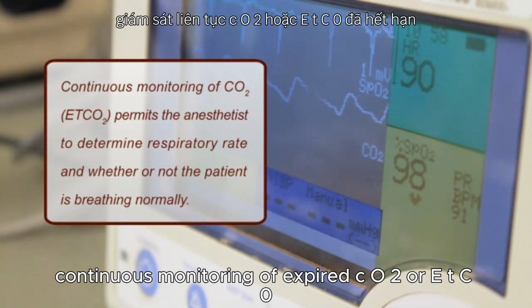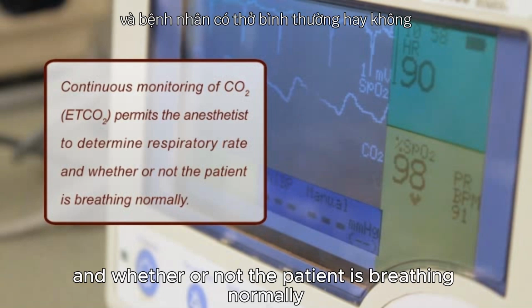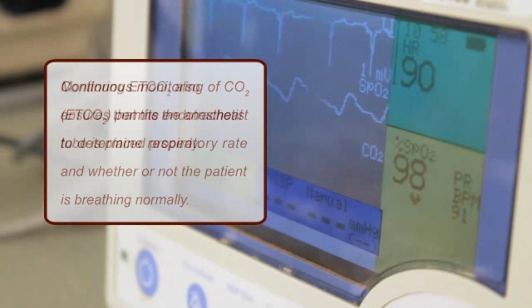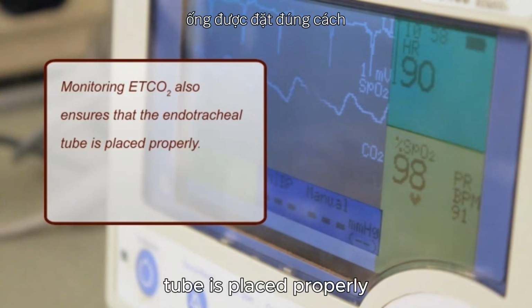Continuous monitoring of expired CO2, or EtCO2, permits the anesthetist to determine respiratory rate and whether or not the patient is breathing normally. Monitoring EtCO2 also ensures that the endotracheal tube is placed properly.